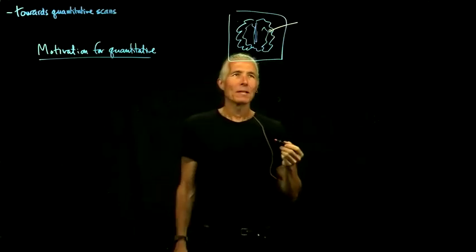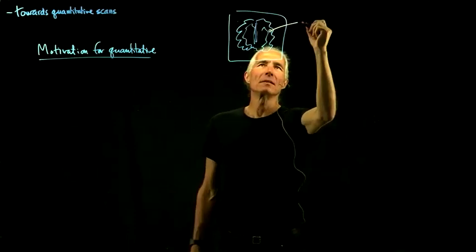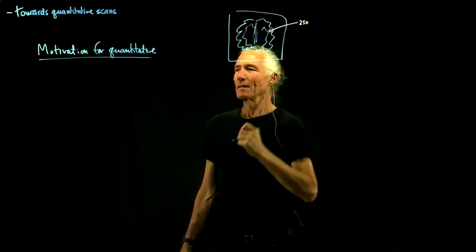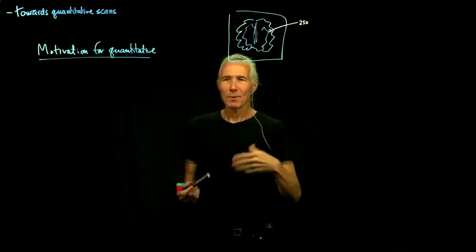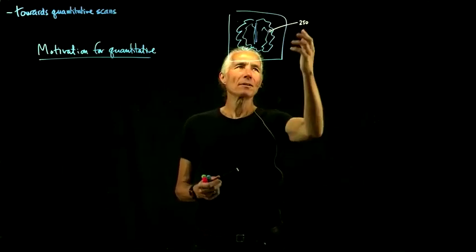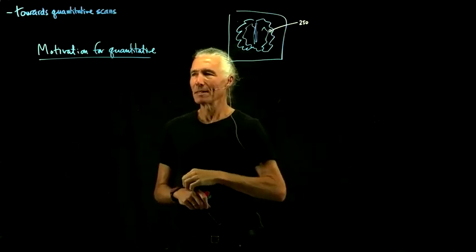On our scanner, that number for gray matter might be, say, 250. But if you take that same person, stick him in the magnet, and do another scan a week later, you'll get some other number, maybe around 300.